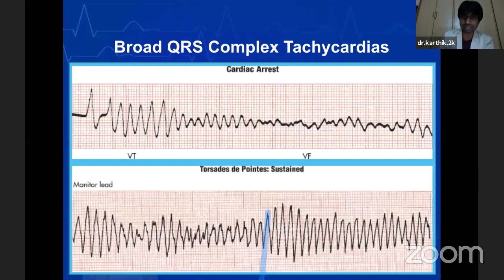So what happens is basically there are certain drugs in medical practice, and being pharmacy students, you'll know them better, that affect the QT interval, and under the pressure of certain influences, patients can throw up a tachycardia like this.